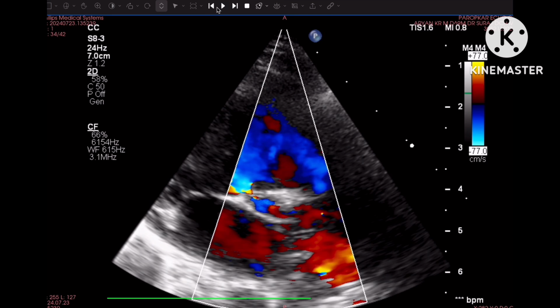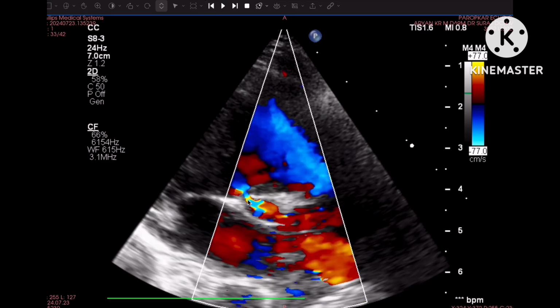See, this is very stenotic. This part is very narrowed, pulmonary flow obstruction. You can see the pulmonary flow. You can just imagine the cursor. See, this arrow can show you this is very narrowed. So there is significant subpulmonary and pulmonary obstruction.